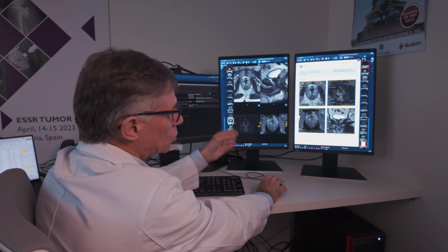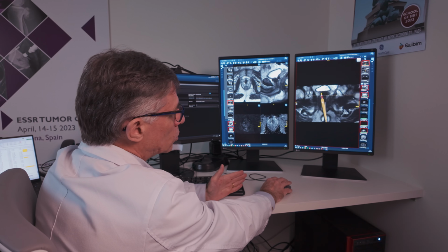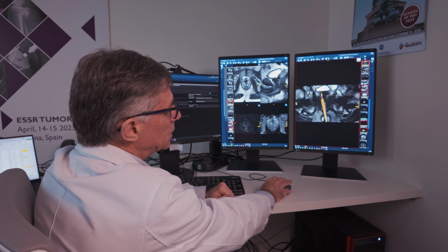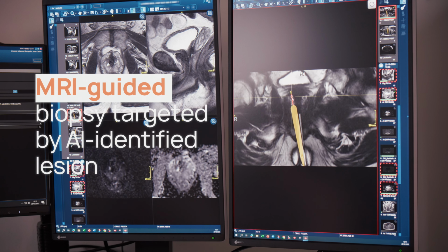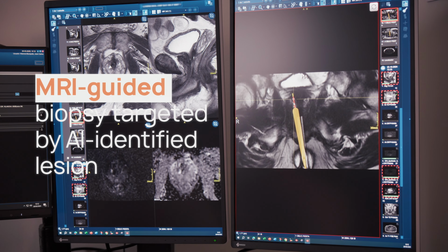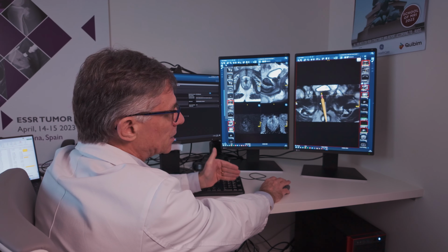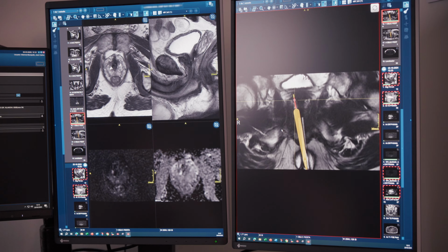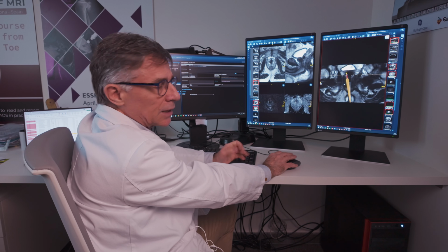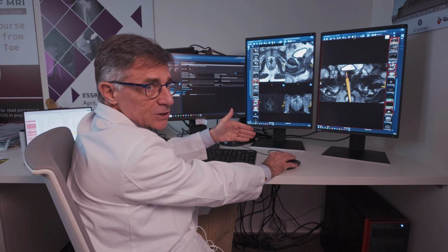The biopsy is done within the resonance, because it is within the resonance where we see the images, which is what we are seeing now. We have inserted this guide and the needle, and we are taking 2 centimeters of prostate tissue. The 2 samples obtained confirmed a Gleason 3+4, that is significant Gleason, which means it requires an intervention or an action. In this case, active treatment, total prostatectomy, and complete resection confirmed a Gleason 3+4.